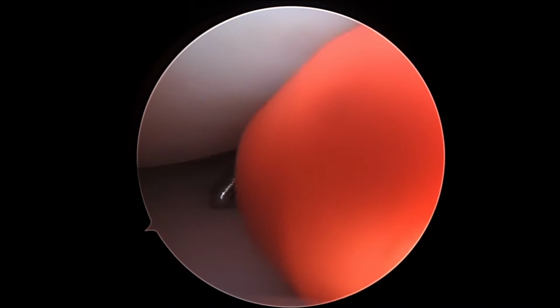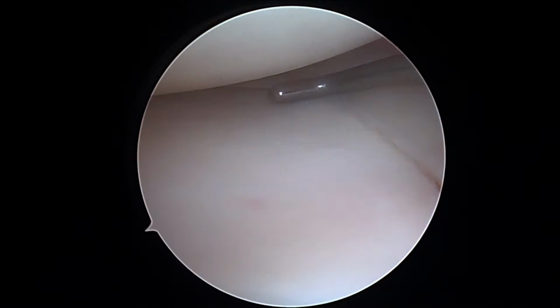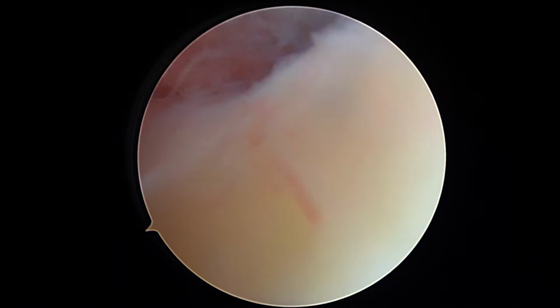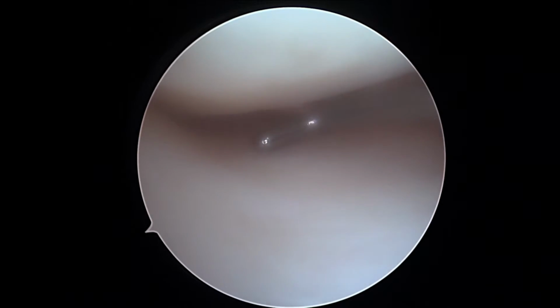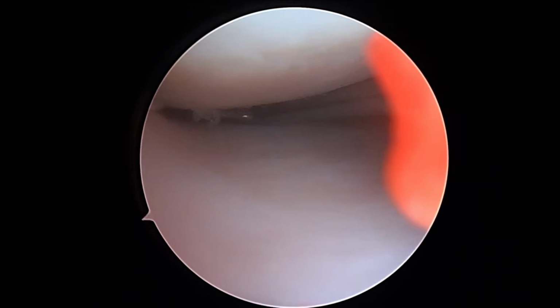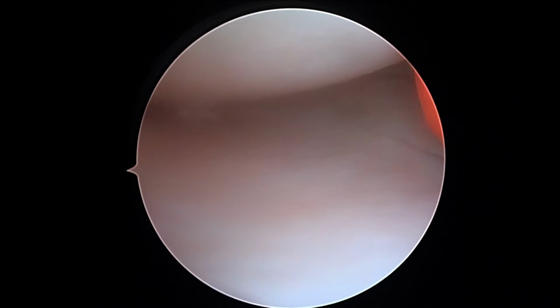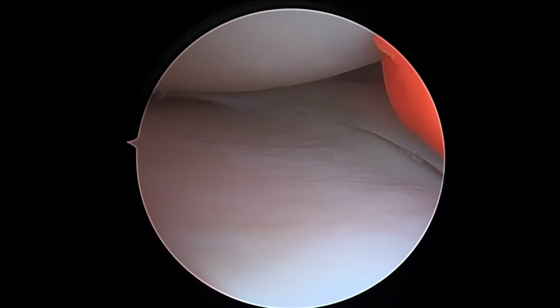So this is the meniscus in the kind of the body and the anterior horn. And then as we get back here, this is more the posterior horn. Hold the camera just for a second. Okay, and so now we'll get back here and look at the posterior horn. We're just waiting for it to slowly clear up here. It's looking a little better.